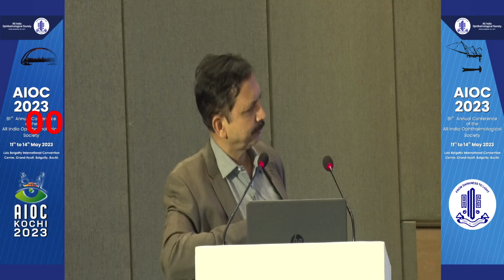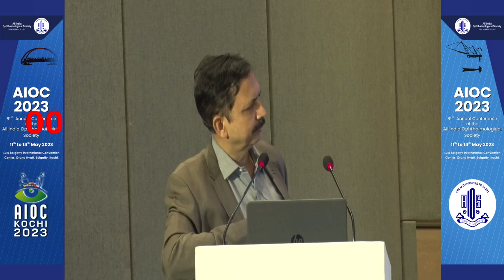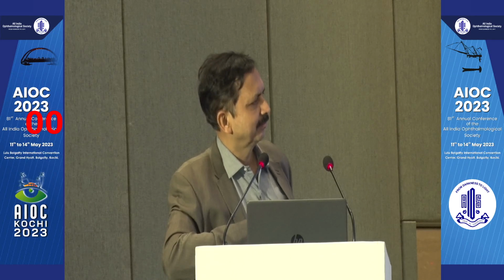It is not very difficult to rotate the lens at all. Just don't sit on it. An unhappy patient is going to go to the next doctor and he will point out the mistake. So maybe 2 weeks would be ideal, not more than that. That should be easier to rotate even these hydrophobic lenses.